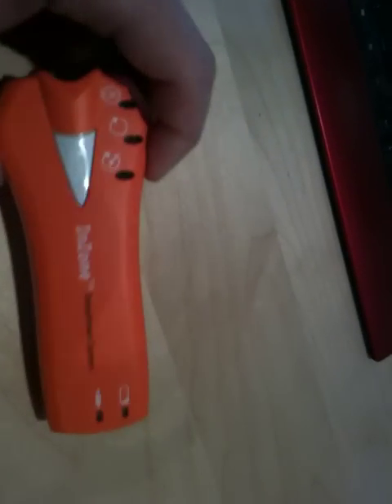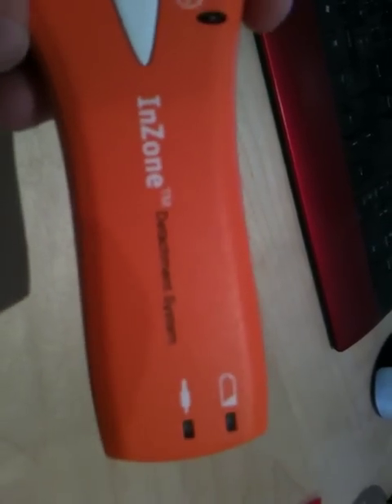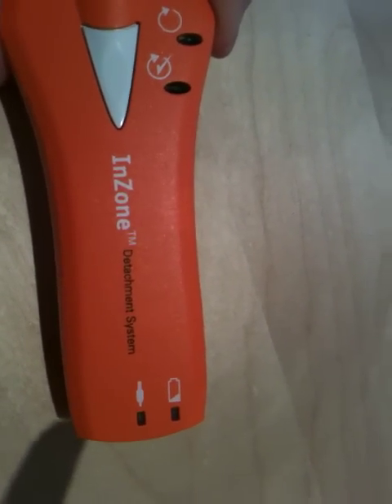Okay ladies and gents, I've got something quite interesting for you today. This is a medical endovascular coil detachment device, and that's a bit of a long, complicated name for a current source.